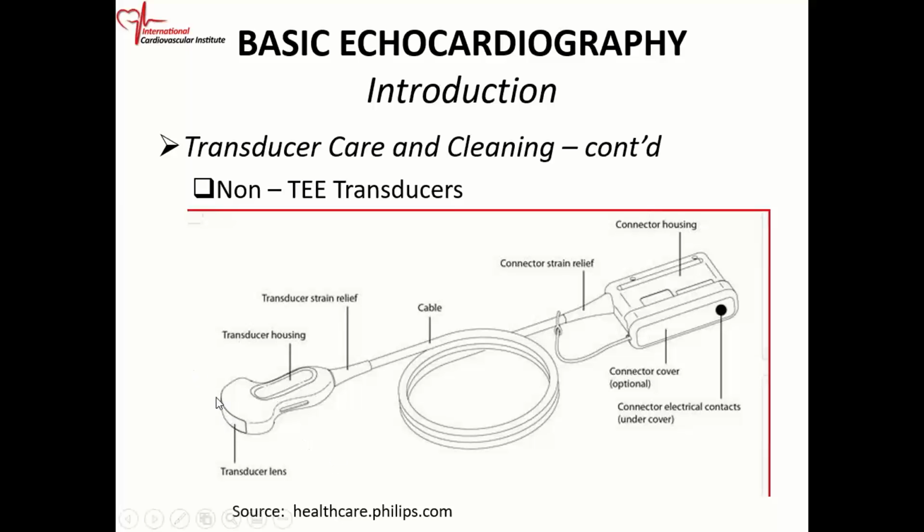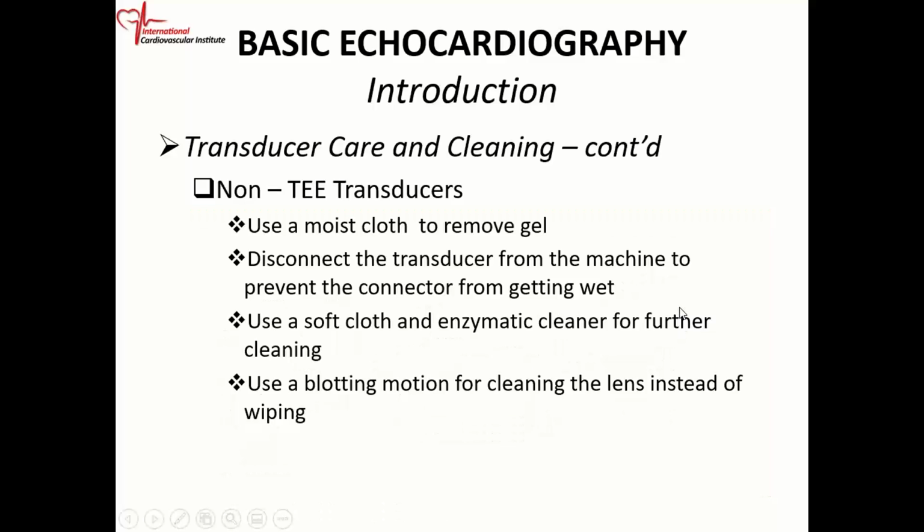So this is the portion you put on the patient's chest. The piezoelectric crystals are here. Once you plug it in, it's going to create the sound wave. The sound wave is going to travel to the patient's chest. It's going to come back. It's going to strike the probe and create the image. And then these are the cables, and this is the connector that you connect to the ultrasound machine.